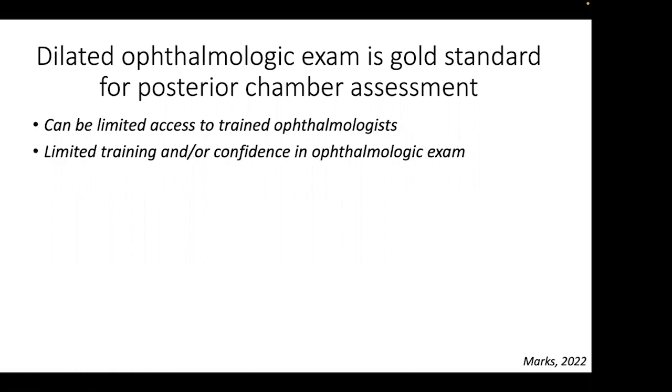Also, many in the acute care setting have limited training and or confidence in ophthalmologic examination. Point of care ocular ultrasound can be helpful, and is relatively easy to learn.